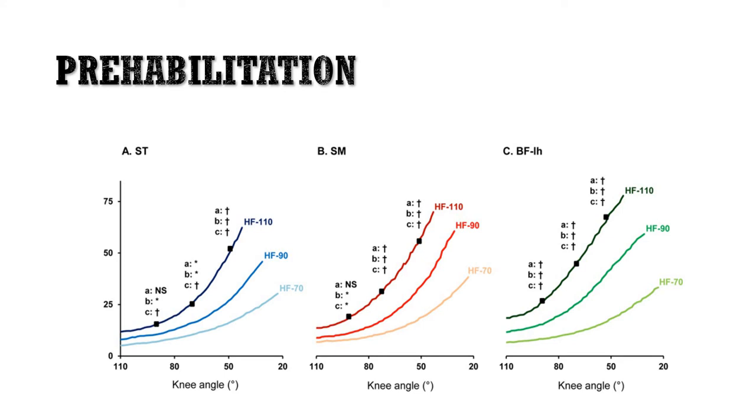So not necessarily always looking for activity in terms of muscle recruitment for exercise training and resistance exercise, for example, but in this case increased activity suggests greater stretch because of a greater stretch reflex, and that is quantified here on this graph.